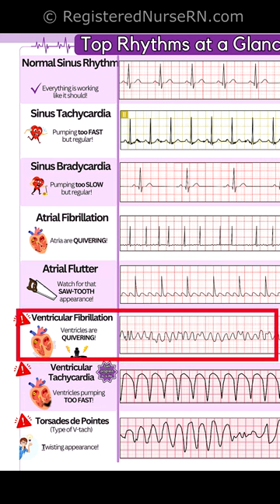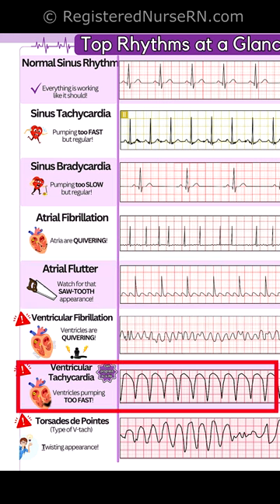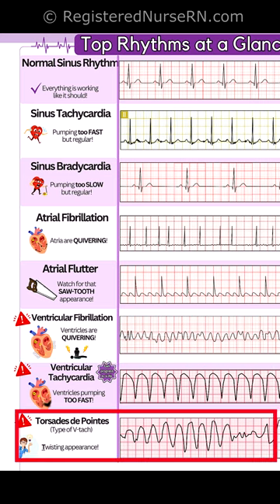Ventricular fibrillation: the ventricles are quivering. Ventricular tachycardia: the ventricles are pumping too fast. Torsades de pointes: this is a type of V-tach with a twisting appearance.